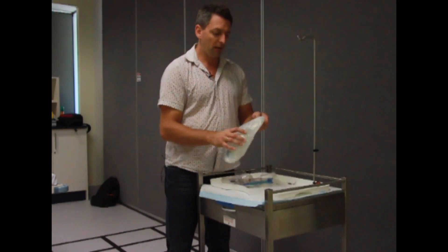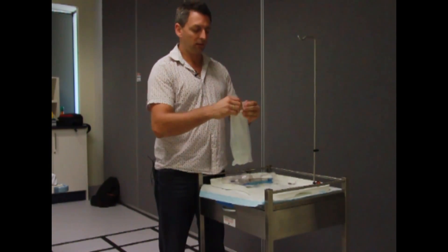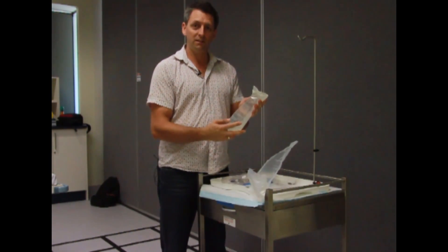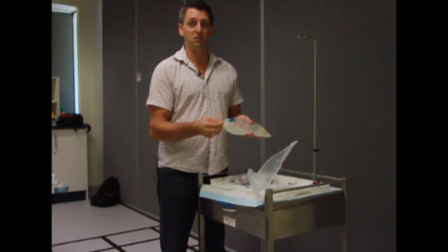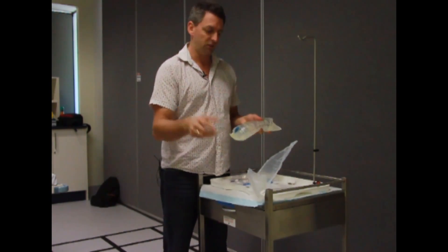I've got a litre bag — make sure it's in the outer casing bag. If you ever find a bag that has just been opened like this, don't use it, because you can tamper with the port; things can be injected and you won't know. So if you see a bag like this, discard it and just get a new bag.